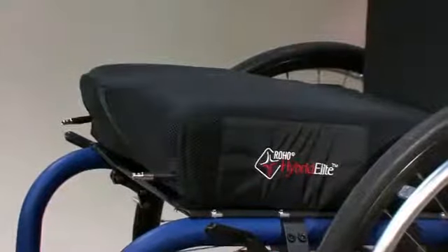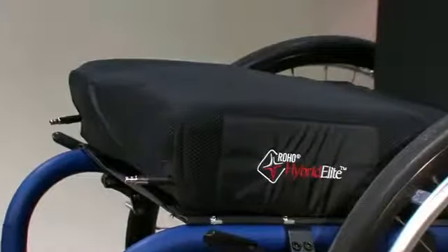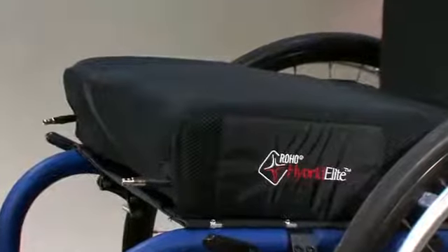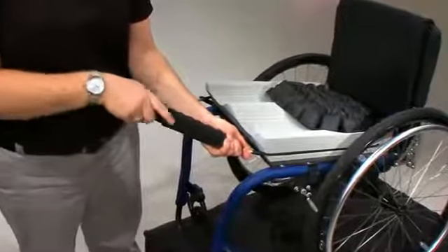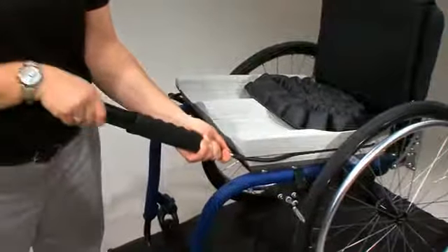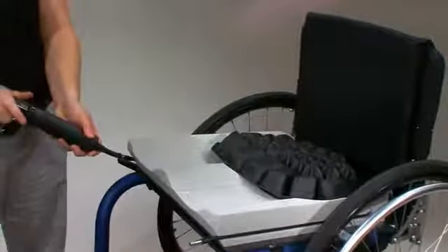Dual compartment cushion inserts may be used for side-to-side positioning. To maximize the positioning benefits for individuals with a pelvic obliquity, the side with the deepest bony prominence must be adjusted first. Once both adjustments are made, recheck each compartment to ensure proper adjustment.